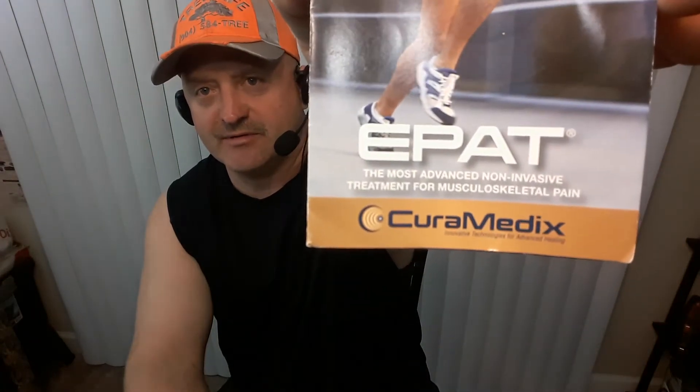This is the treatment I've been going through. Basically it's like a sound pulse — a very strong pulse that goes into your heel and your foot. It's also used in plantar fasciitis, which I don't have. I mainly have the Achilles tendon problem, which is the attachment with your calf muscle. It's one of the biggest and hardest tendons in the body.